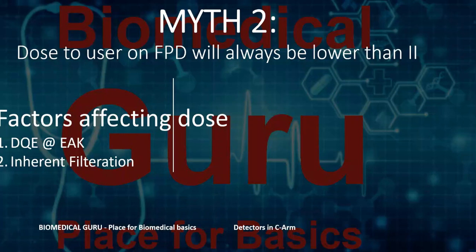When we talk about the inherent filtration, it is the total filtration that is given on the tube. There is no guarantee that the tube will give you only high powered X-ray, which is the hard X-ray. So the tube will emit some hard X-rays and a fraction of soft X-ray. Soft X-rays are the X-rays which are not useful for creating any image. They are either absorbed by the patient or they are scattered around to the user.